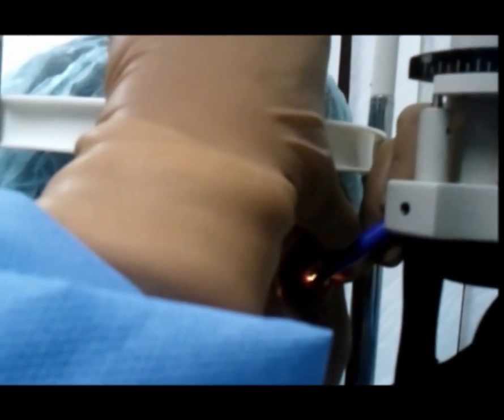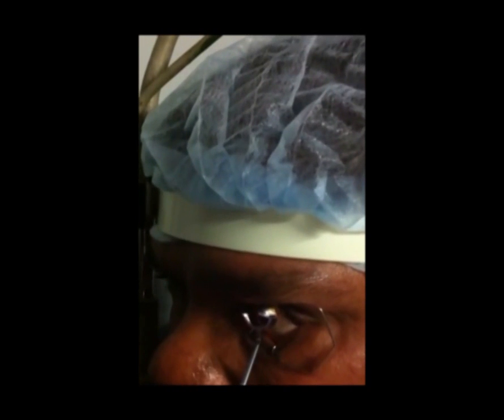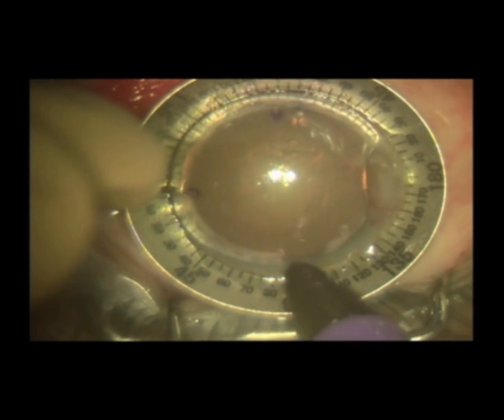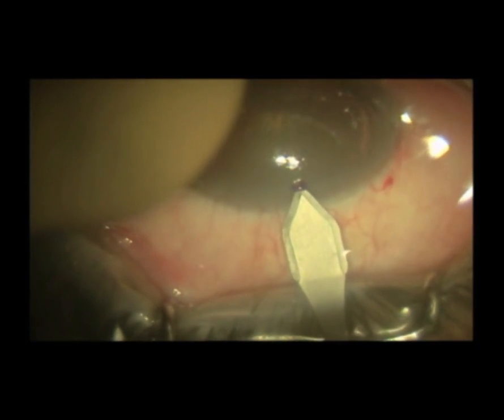Realize that the pen alone does not work, gets washed away, especially if used on the conjunctiva. The needle can be used with the pen, but this is what happens. The eyeball moves, seeing the needle approaching the eye. Using a toric reference marker on the slit lamp worked better than the needle and the pen. The preoperative reference marks placed on the cornea usually stay and are used as the benchmarks to mark the site of incision intraoperatively.